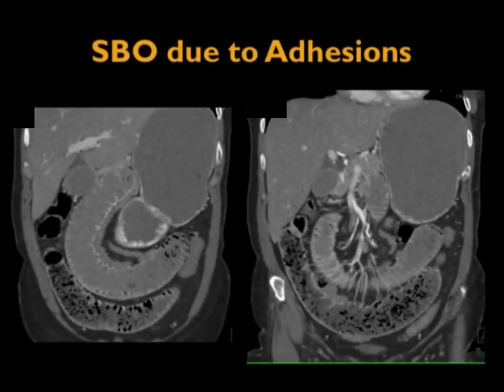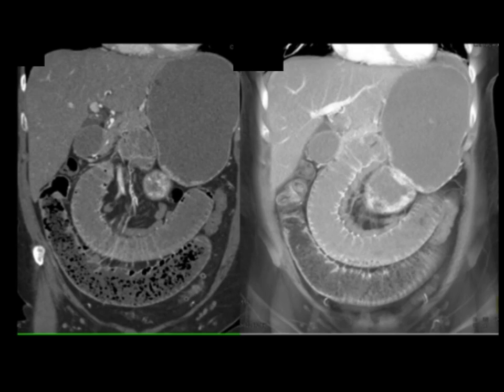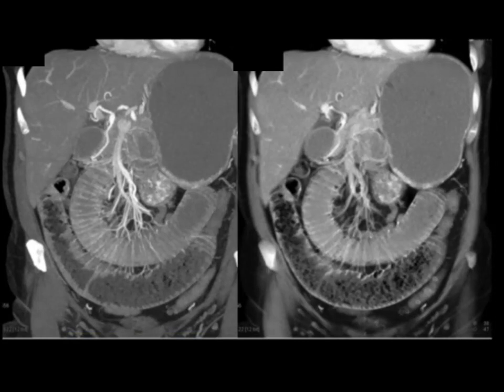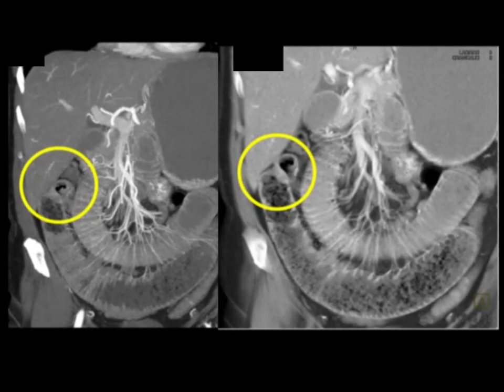In this case, water is the oral contrast agent. The bowel is dilated proximally. We follow it downward and see what looks like feces in the bowel — food matter. Following it toward the right upper quadrant, you can see the transition point where the bowel is no longer distended, where the feces sign stops. This was the patient's cause of obstruction — adhesions. There's no tumor, no malrotation, no internal hernia. The patient had had a prior appendectomy.